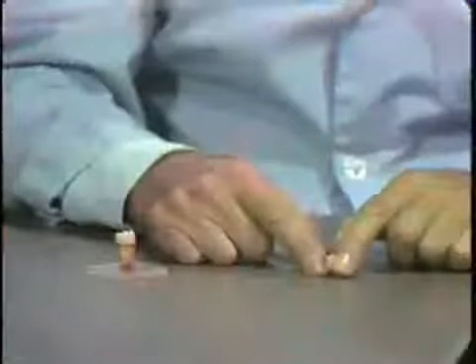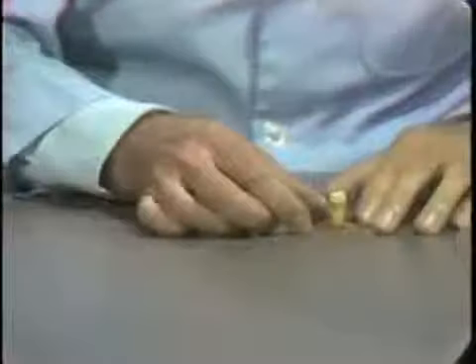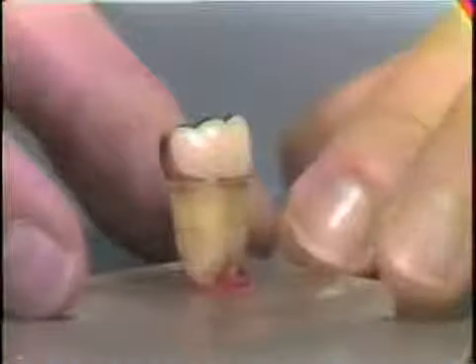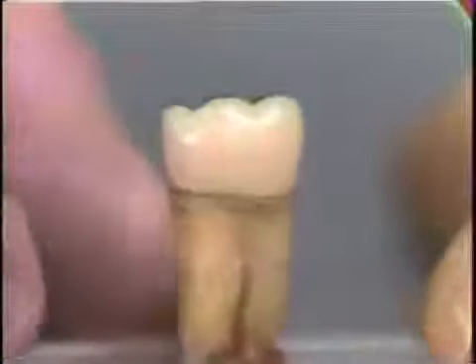vital tooth. Let's return now to the first model just to summarize the amalgam core crown. A restoration which can be used as a bridge retainer on a vital tooth anywhere in the mouth in which most of the coronal tissue has been lost for some reason or another. The amalgam core crown can be restored with a complete crown of any type, either a veneer crown as is seen here, or an all-gold cast crown, or any other type of crown which is desired. The amalgam core crown then, amalgam pin retained on a vital tooth.